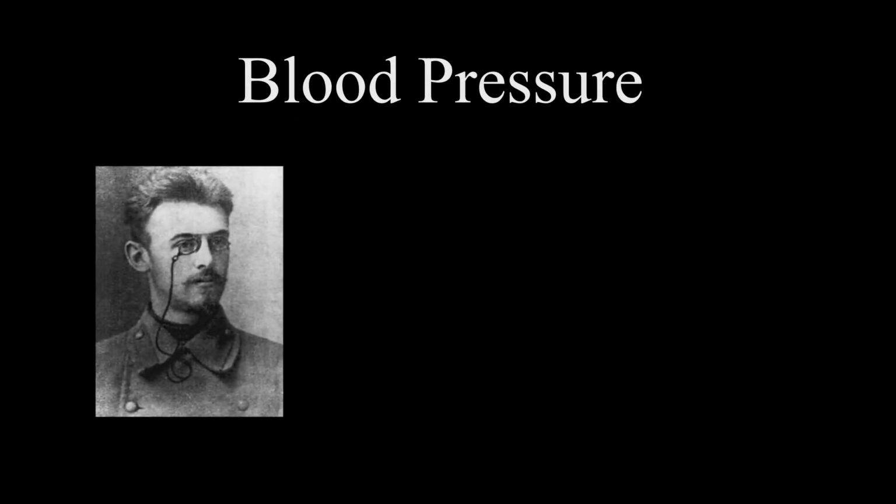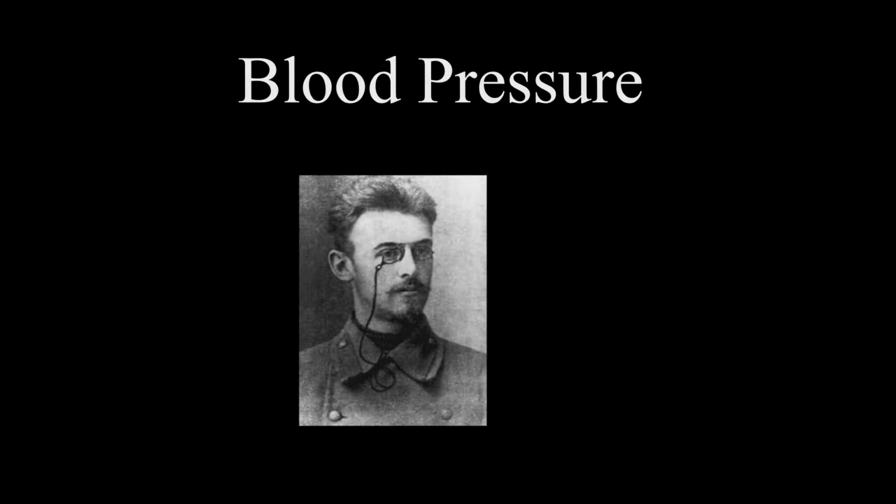Hello, today we will be reviewing a blood pressure assessment to include basic history, blood pressure measurements, completing a pre-assessment, and performing a step-by-step blood pressure assessment. This process was created by Russian physician Dr. Nikolai Korotkov.